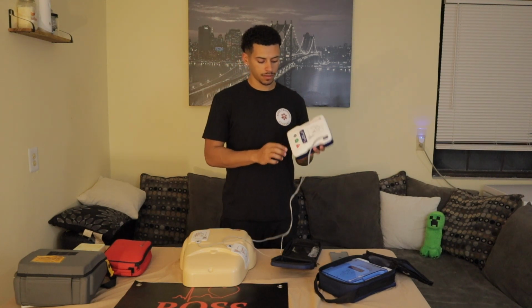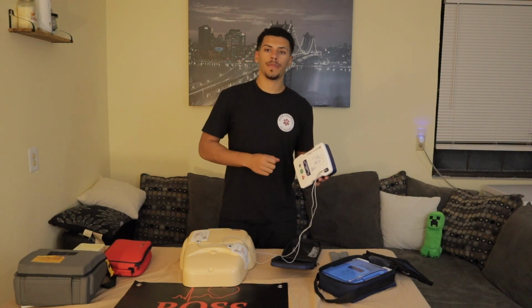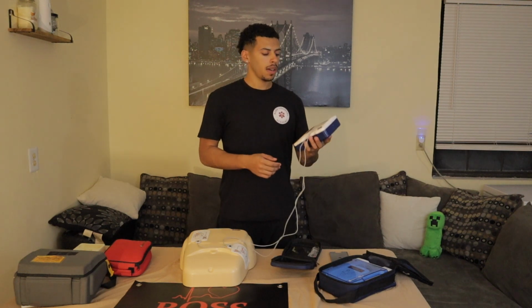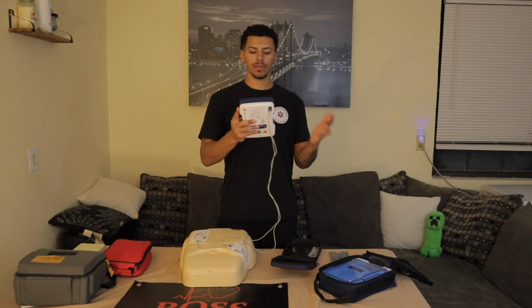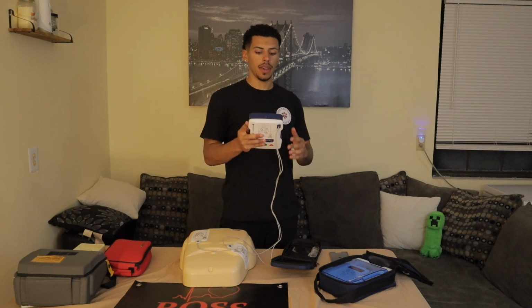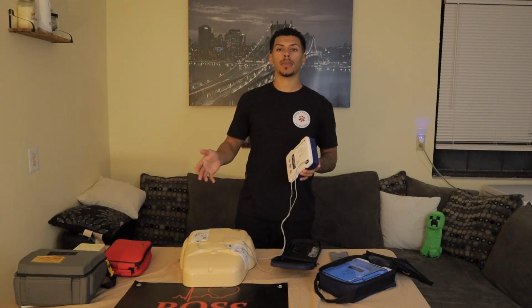And that's pretty cool. It'll start counting out 10, 20, 30, and then it'll tell you to do your 2 breaths. But that's it. This thing is pretty cool. I really like them. They do have their purpose. They have their place. I just don't use it all the time because I do have other options.